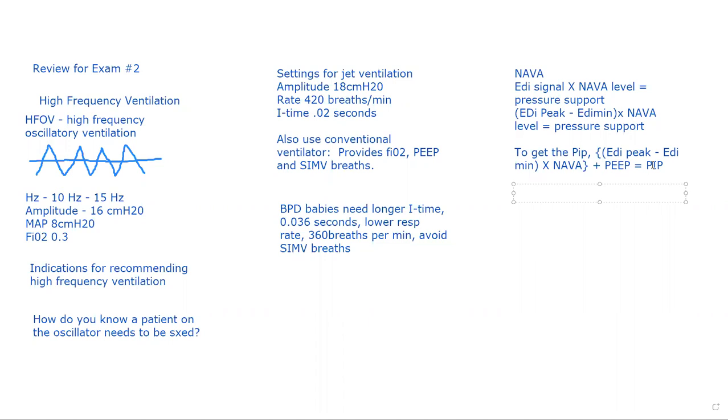That boggled my mind until I realized that it's mostly airway resistance and that pressure is nowhere close to what's arriving at the alveoli, especially when they have nasal CPAP. So you've got air going into the back of the nose. There's a lot of airway resistance there, getting through the conducting airways. So those high pressures that we see on the neonates are not the pressures that are occurring in the alveoli.